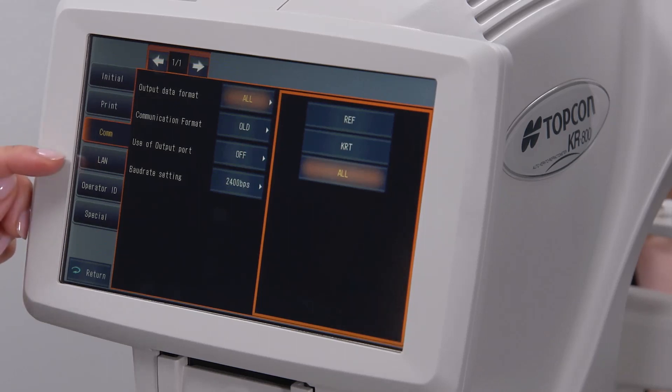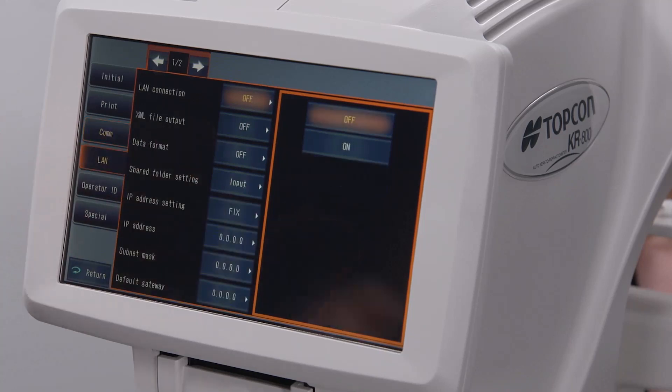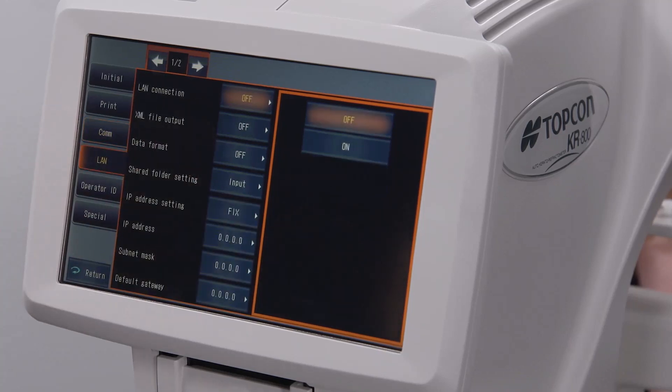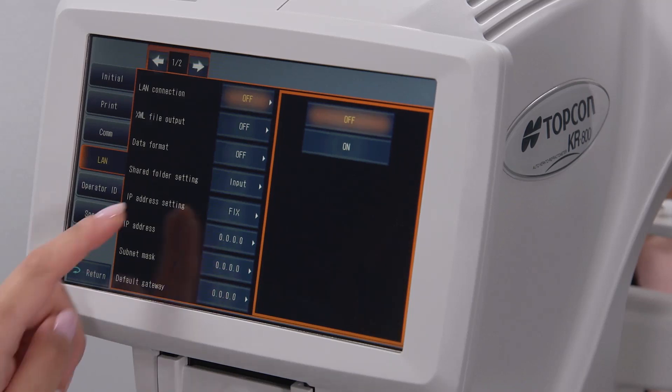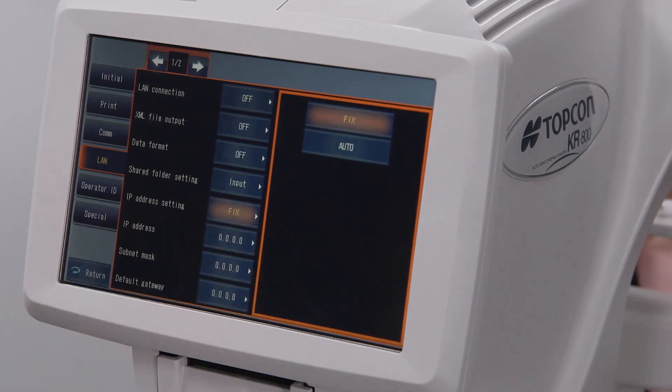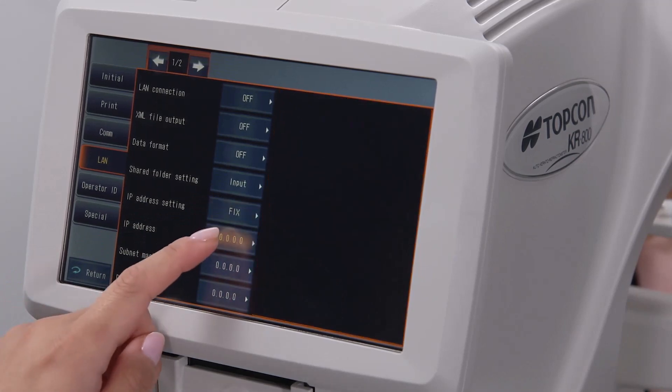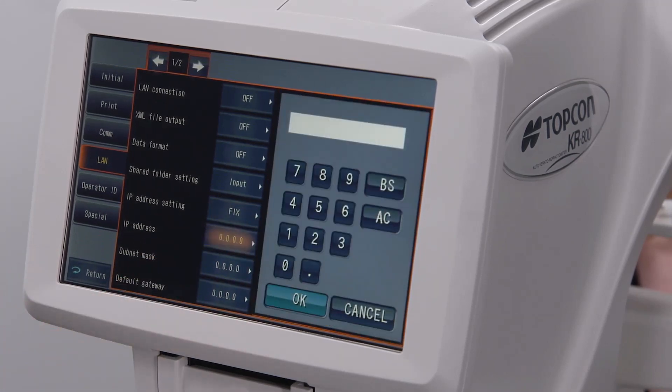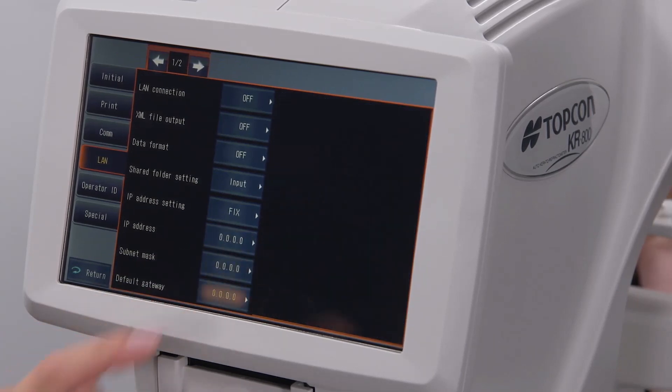The LAN or local area network tab contains options involving exporting data through an ethernet cable. These settings include whether the IP address will be automatically or manually assigned, and options to manually set the IP address, the subnet mask, and the default gateway.